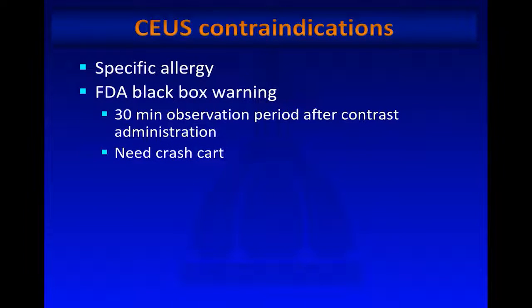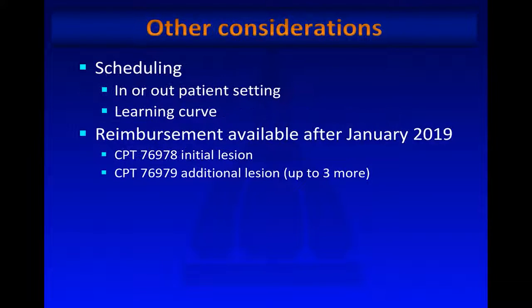The contraindications are specific allergy, which is uncommon. And there is an FDA black box warning, so you have to observe the patient 30 minutes after contrast administration, and you need to have a crash cart in the area, just like you would for CT or MR.